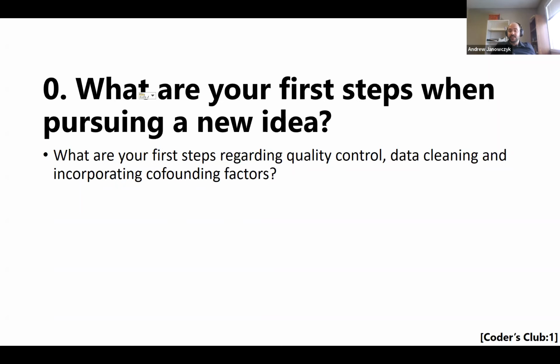You can't use a deep learning experiment to do that, because the first thing it's going to do is just learn that pink slides are good prognosis, which is obviously rubbish and something that should have been ignored. So I think trying to keep these things into account is consistently challenging. I'll just add that we should fairly soon have a HistoQC plugin for digital slide archive. So Andrew and I are working on that.